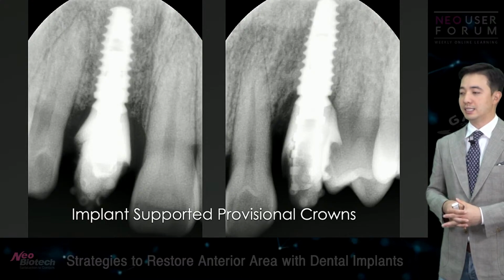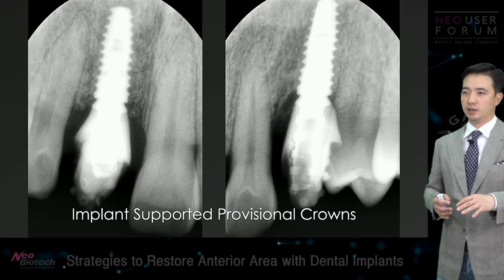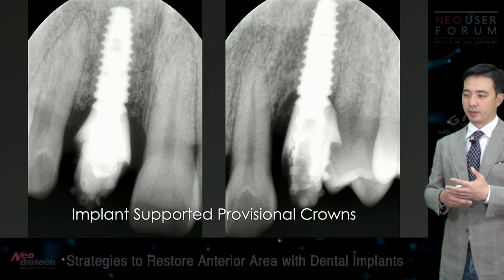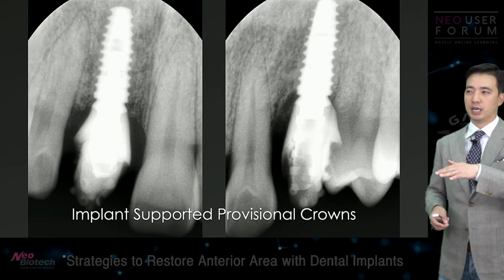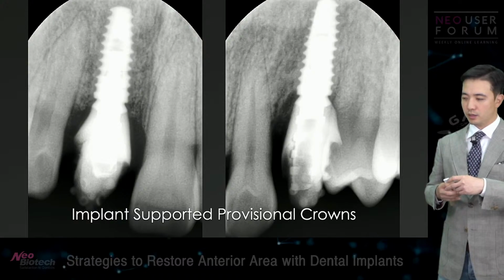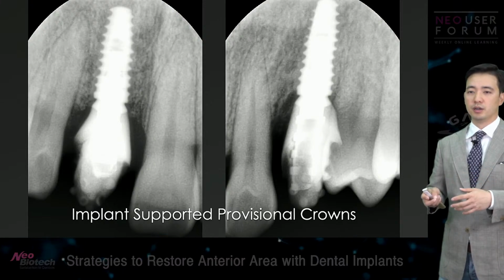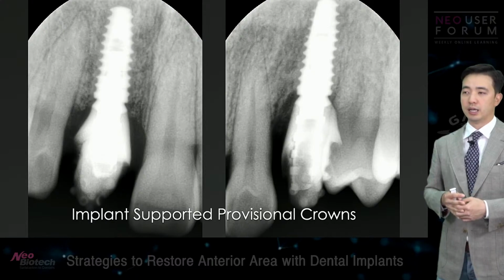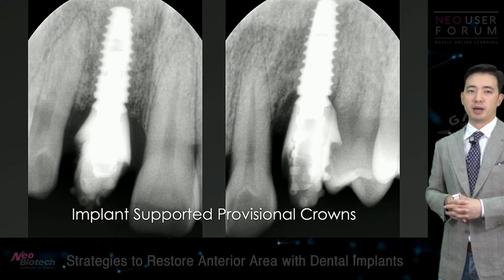So I did risk it for that case, but it was not a big deal because the patient already had periradicular pathology. So what I did was I sectioned the root, and then I tried my best to surgically remove all those infected tissues. I did fail for number 22. If I were to do that case again, I think I'd probably do the same, because I do have a backup plan.